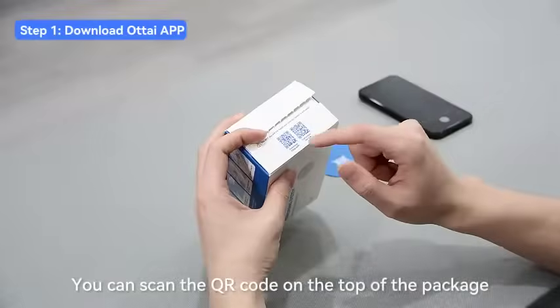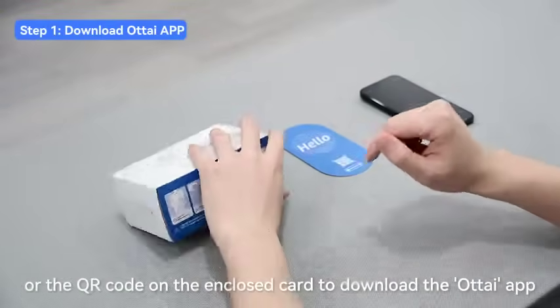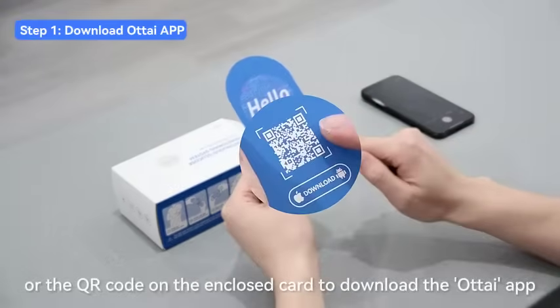You can scan the QR code on the top of the package or the QR code on the enclosed card to download the Otai app.